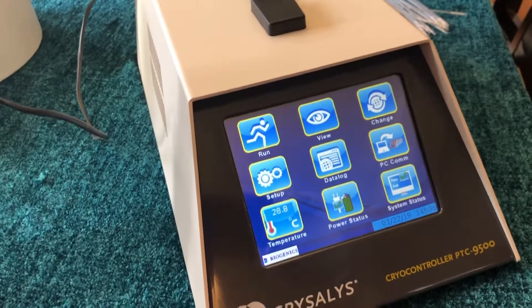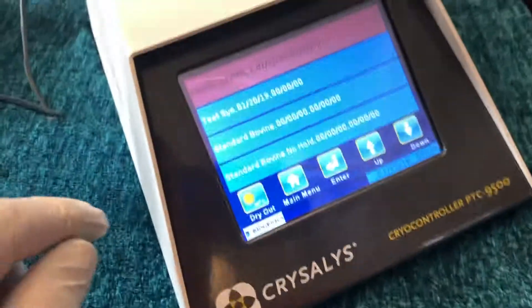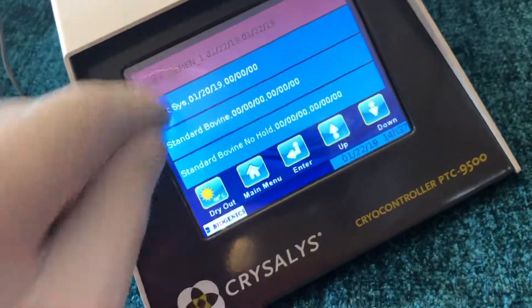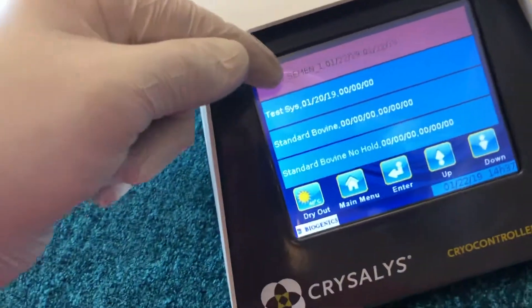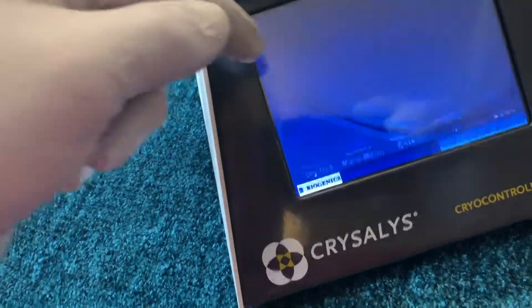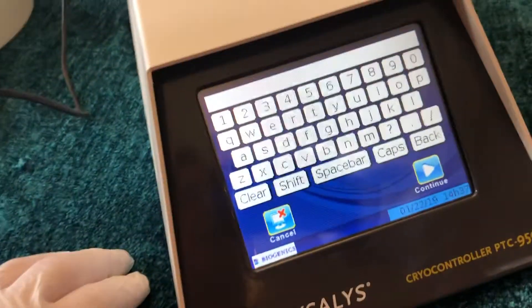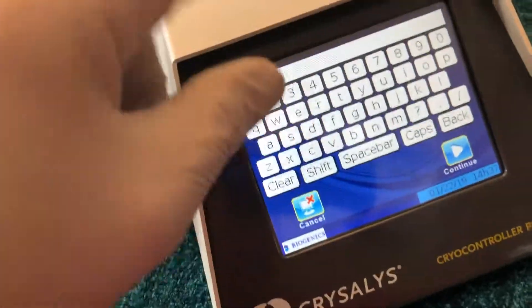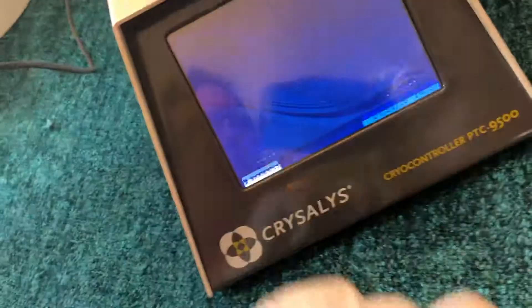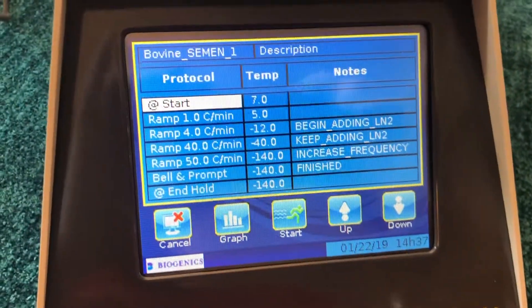Without further ado, let's set up to do a bovine semen freeze. We go to Run, select the program called Bovine Semen 1. The last program you use always comes to the top of the screen, making it easy for routine use. This keyboard is if you want to enter the name of the donor, farm, or other details — but you don't have to. The program is still time and date stamped.